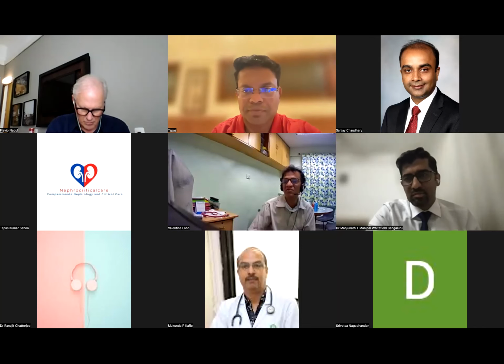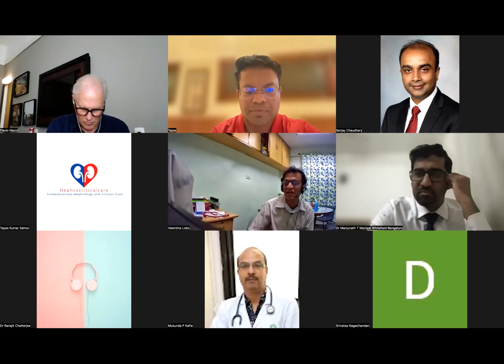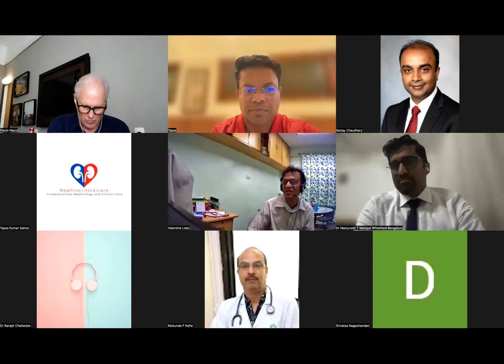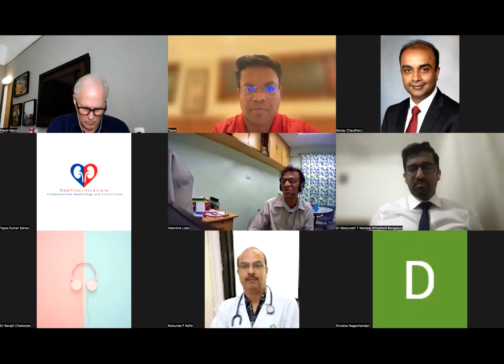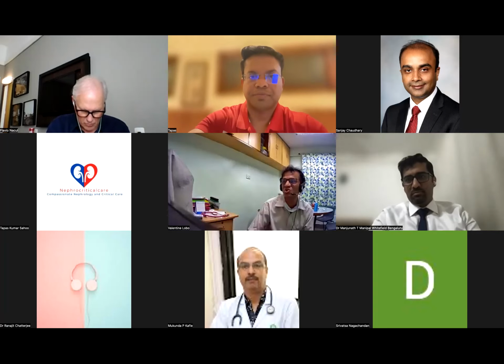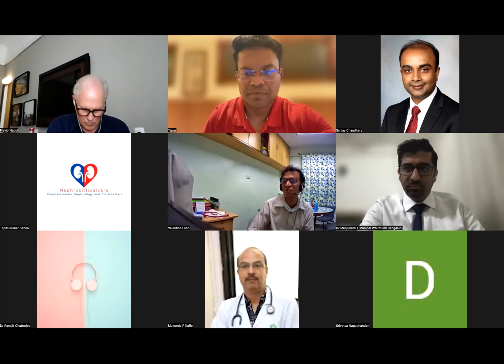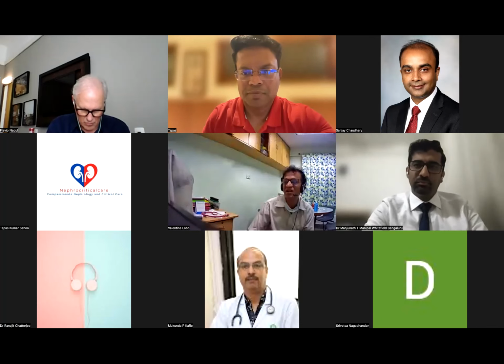But today you have software, you have machines which have great memories. You can collect the entire information with a pen drive, take it away and study it at leisure. So all this is available on the machines today. We can collect all the information before the next patient treatment. What I would say is visit the machine several times a day, go into the history menus, and look at the events which have happened.